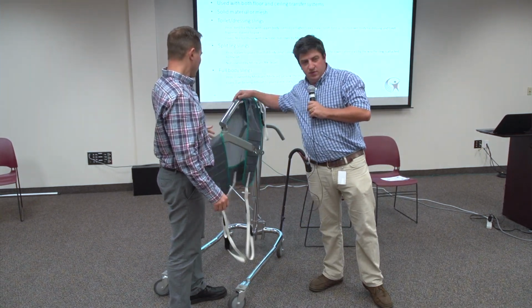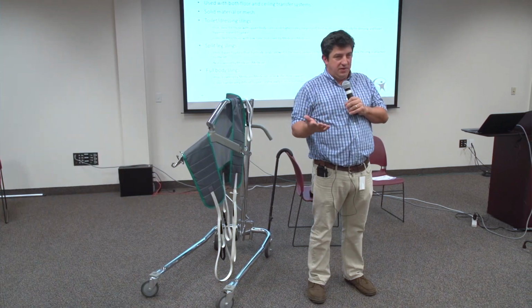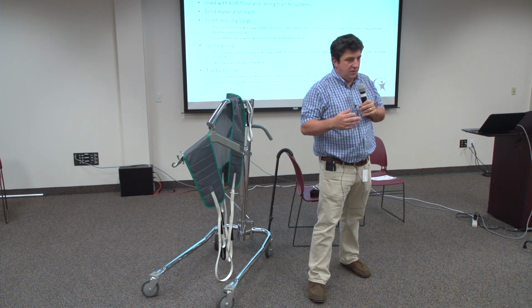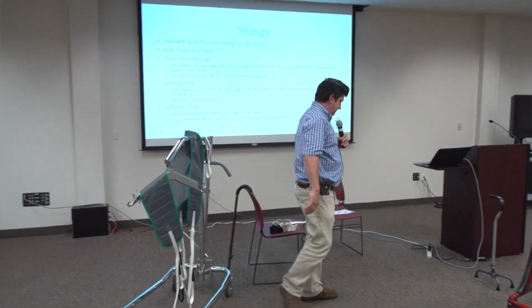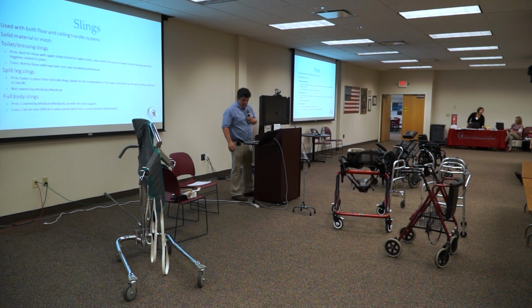I think one of the reasons caregivers don't use lifts is because of the sling placement and how difficult it can be. So if a person has a higher tone, a little more upper body control, the toileting dressing slings are something to look into. They're not covered items by Medicare, Medicaid, but if the person has a waiver or some community funds available, they can be pursued.